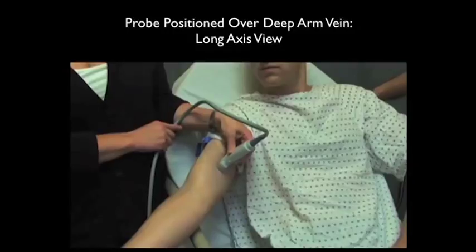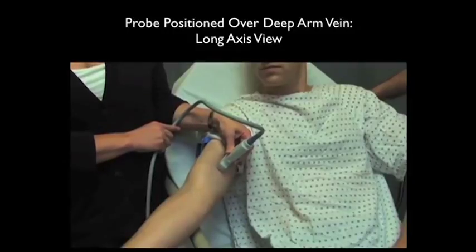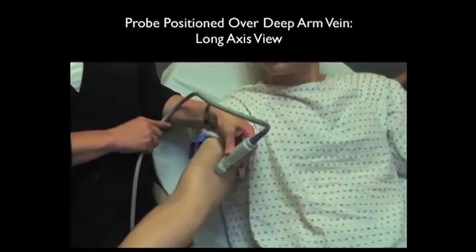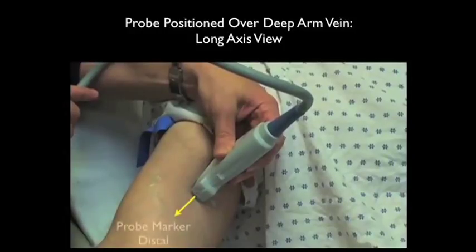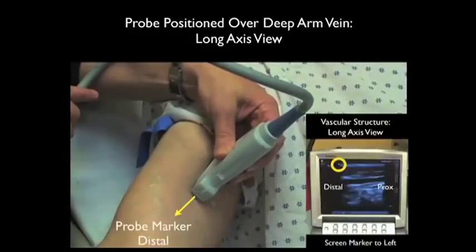Here's the high-frequency linear type array probe in a longitudinal or long axis orientation over the patient's upper arm. Here it's located over the more medial basilic vein. In this orientation, we have the probe marker going distally, and this helps us line up the probe with regard to the screen. Notice the screen indicator dot here is located towards the left, therefore distal on the screen would be over towards the left, and proximal on the screen would be located over towards the right.